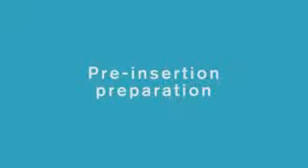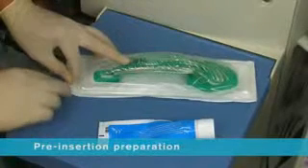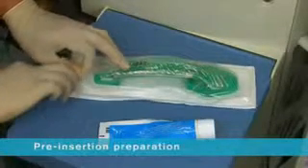Pre-insertion preparation. iGel is supplied in a sterile pouch enclosed in either a protective cradle or a cage pack. This innovative packaging is color-coded for size and designed to ensure the device is maintained in the correct flexion prior to use. It also acts as a base for lubrication.